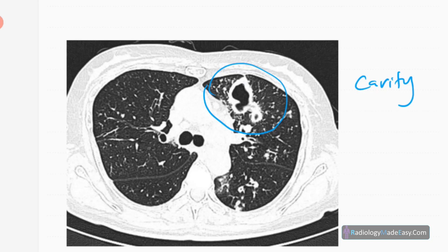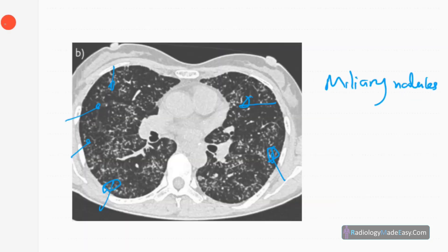Multiple centrilobular nodules with a branching pattern is called the tree-in-bud appearance — it indicates active TB. The final finding is miliary TB on HRCT. You can see randomly distributed nodules, soft tissue density, 0.5 to 2 millimeters. Unlike tree-in-bud where nodules are centrilobular with a branching pattern, these nodules are randomly distributed — called miliary nodules, indicating hematogenous spread of TB. That concludes pulmonary TB imaging.